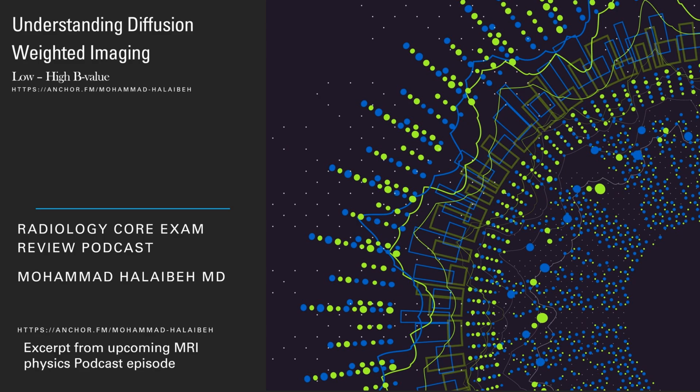Now, a question can be asked along the lines of what is the effect of using a high b-value or lower b-value? Remember what I said, a higher b-value determines the amount of signal loss that is due to diffusion. So the higher our b-value, the more signal we're going to lose from that. So we do not want to set our secondary b-value to be too high because we will increase our noise.